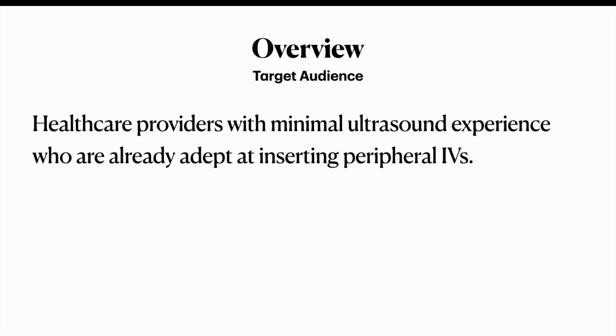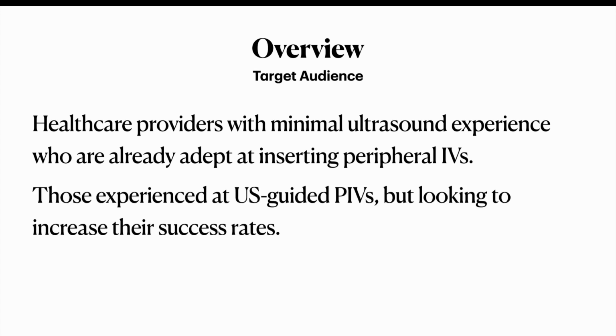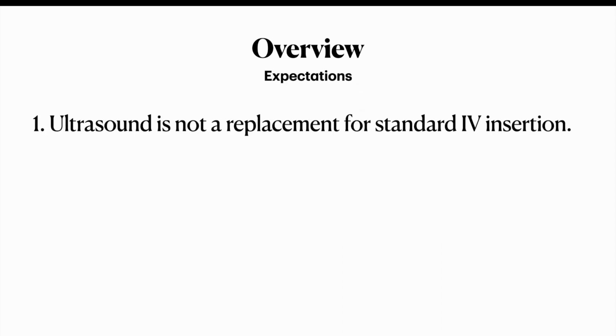The target audience for this lecture will be twofold. It will be for those healthcare providers with minimal ultrasound experience who are already adept at inserting peripheral IVs, but it will also be for those that have already garnered a lot of experience performing ultrasound-guided IVs but are looking to increase their success rates. Particularly the second half of this lecture will be useful for those that already have a good amount of ultrasound experience. Just a few expectations before we get into it.